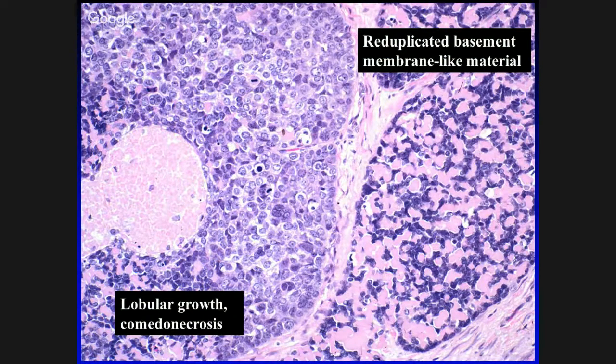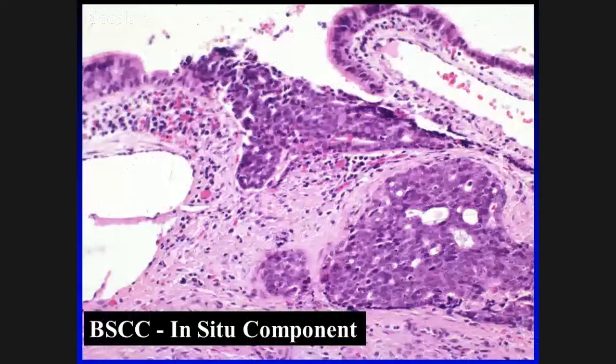salivary gland tumors like adenoid cystic carcinoma. But if you look at the nuclei here, the typical adenoid cystic are like watermelon seeds. They're small, they're angulated, and they're extremely hyperchromatic, and uniform, with hardly any nuclear pleomorphism and hardly any mitoses. When you look at this, even in a limited biopsy, there's marked nuclear pleomorphism and a high mitotic rate. And that is a simple way of separating them out.